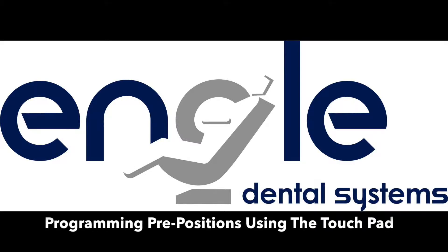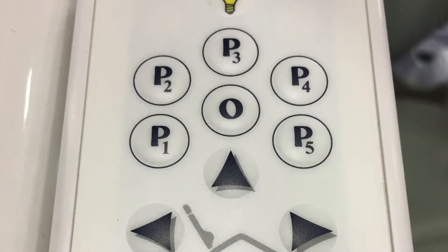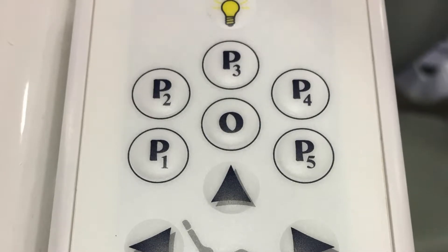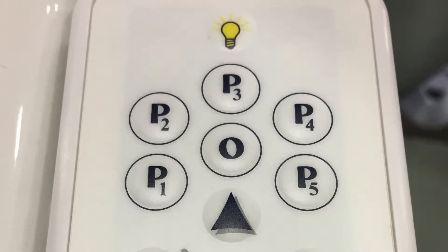Programming pre-positions using the touchpad on an Engle 300 series chair. P1 through P5 buttons located on the touchpad are used to automatically and consistently position the chair to a pre-programmed position. One pre-programmed position is allowed per button.